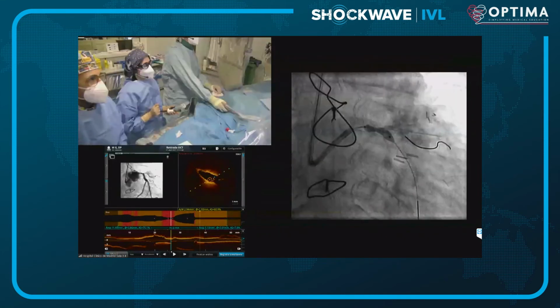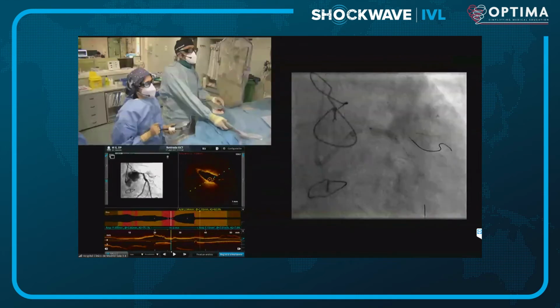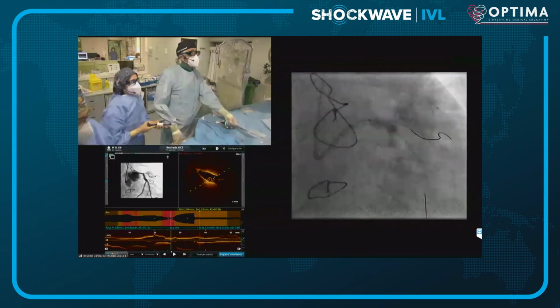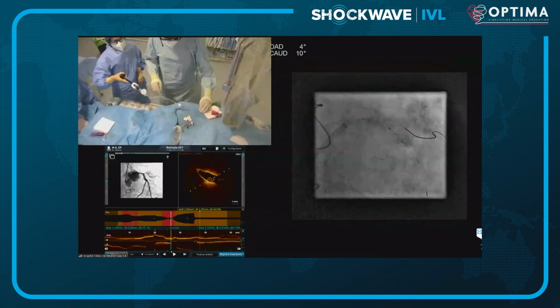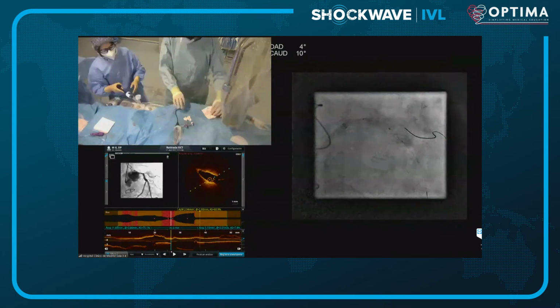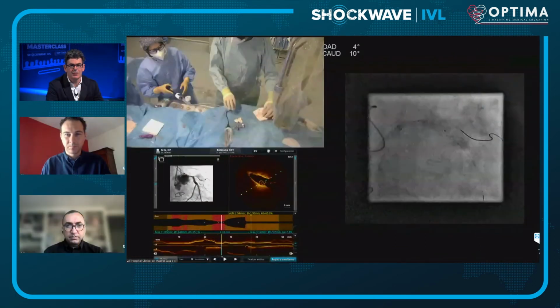You can see the waist there. We will monitor this waist. What you can do is try to find the view that is more orthogonal to the waist, so we can really see better the action we are obtaining. I think that this is probably the most orthogonal one. No, viste todos los shocks. You really want to get the emitters as close as you can to the tightest area of concentricity here.